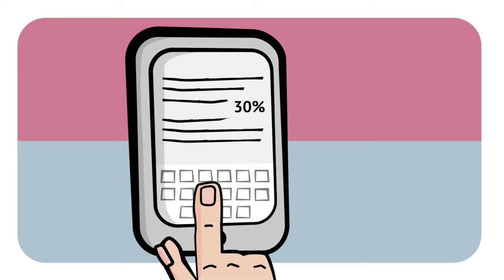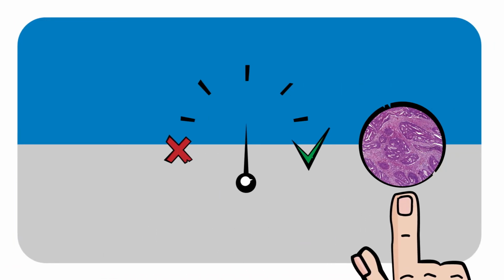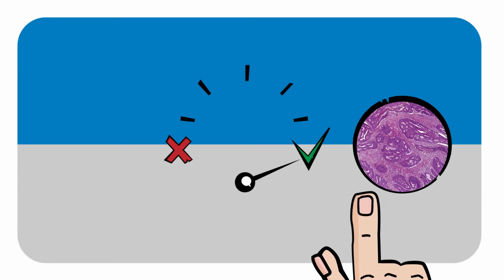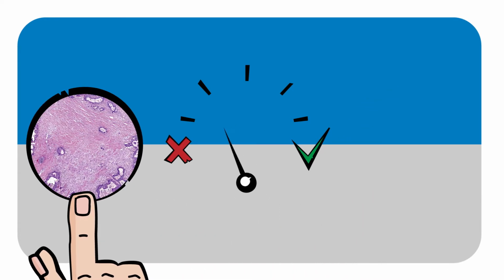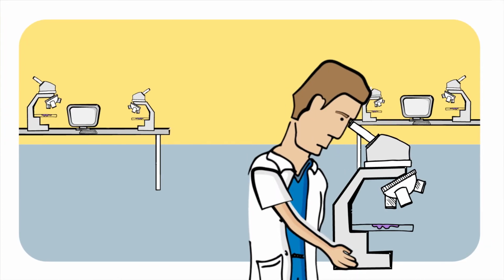When there is 50% or less stroma, we classify this as stroma low and the patient has a better prognosis. Over 50% stroma indicates stroma high. The patient then has a worse prognosis. Why that is the case is as yet not entirely clear.